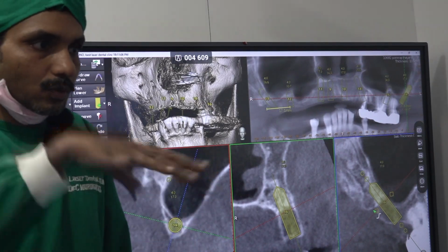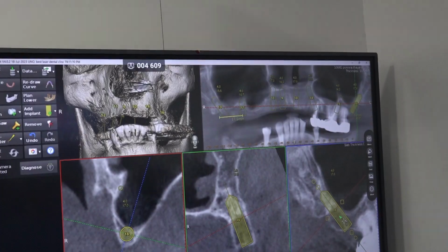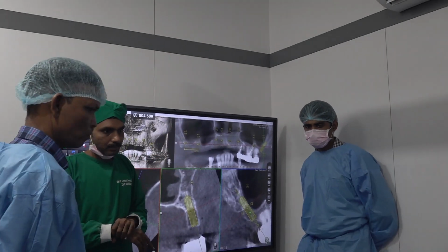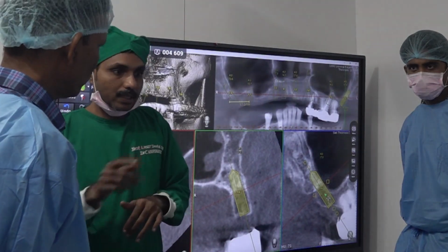So those 3 people who didn't come for the lower jaw, we will start. No, it is straight multi-unit. The body will be straight. I will show some. It was tilted slightly. It was tilted. Simple dent, it is 15 degree.